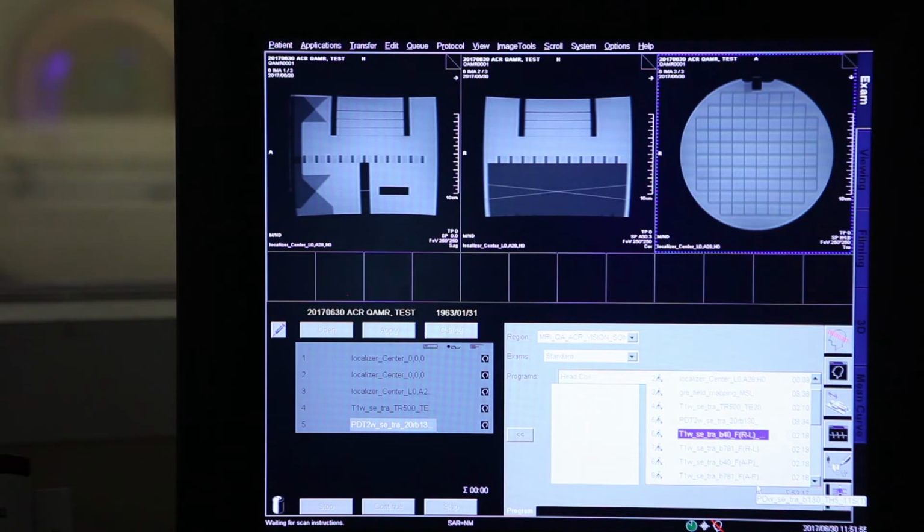Okay? How do we continue after that? These are the sequences that we have to do because that's what the ACR says has to be done. Practically, the American College of Radiology wants to have the sequences in order to control the machines. That's the whole story. Now, the next step is to measure the homogeneity of the static field.